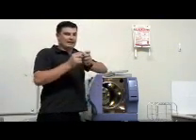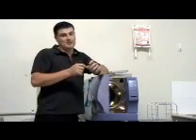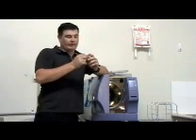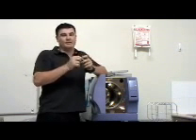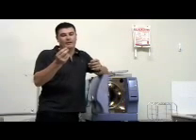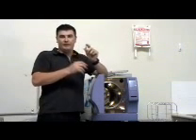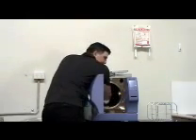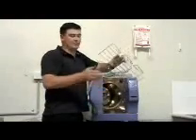For cleaning this, it is aluminium, and washing this under the tap will be fine. If you have any little bits of built-up lint within the mesh that you need to remove, a wire brush will be sufficient. You're not going to damage the surface of the aluminium. Okay? When your filter is nice and pretty, like it is now, we simply push the drain filter back into place.